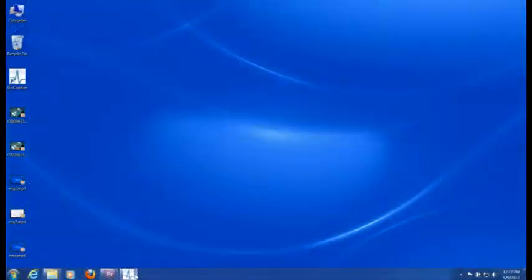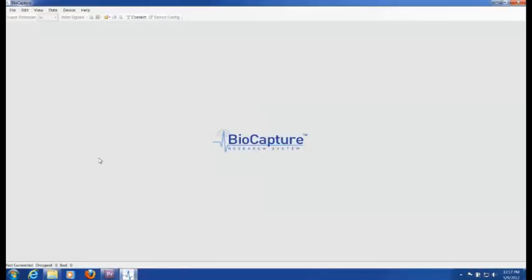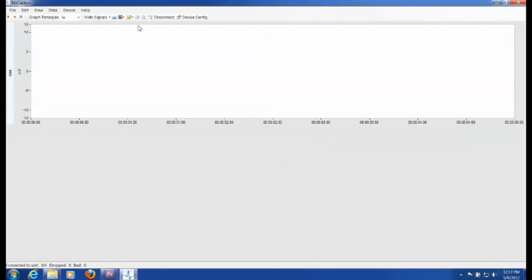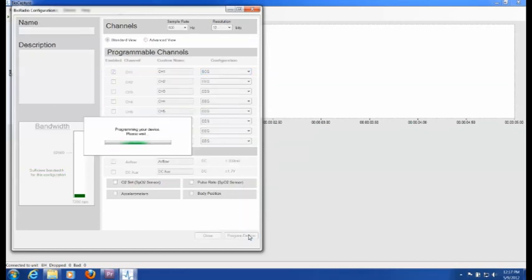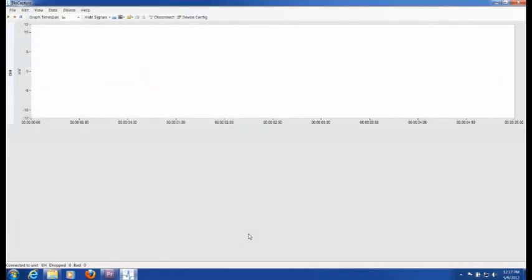We will then run BioCapture and press connect. We will then press device config and program the BioRadio for one channel of ECG. We will then press start acquisition and change the scaling to autoscale continuous.